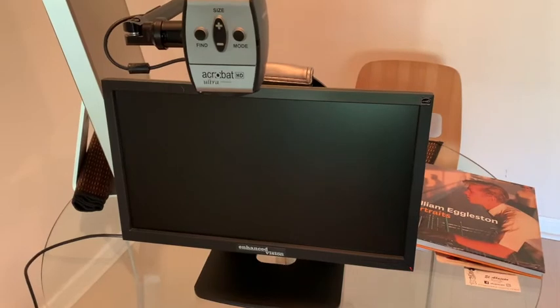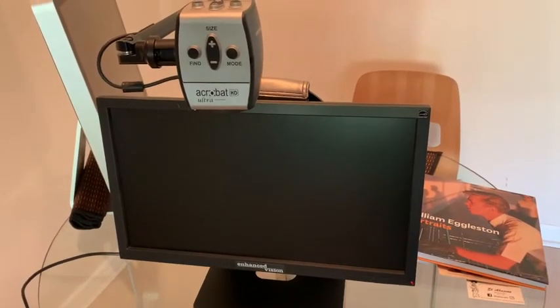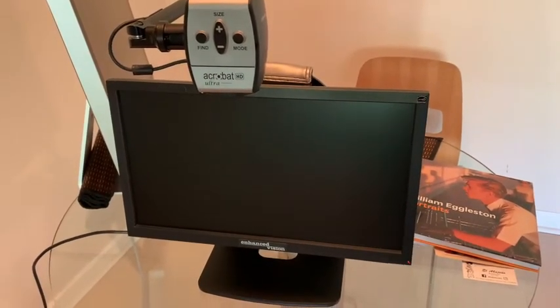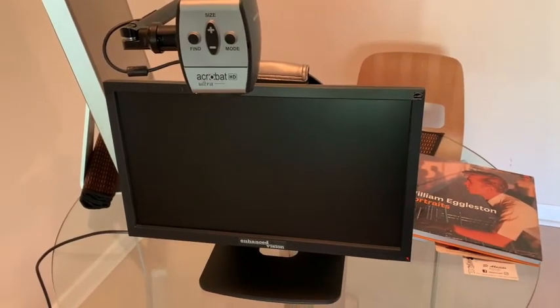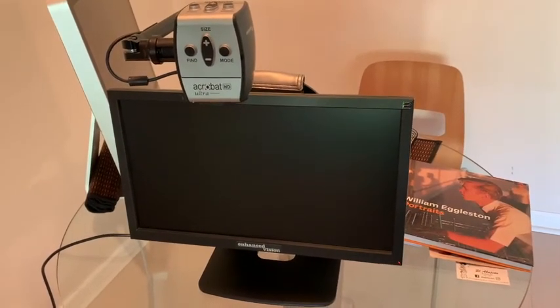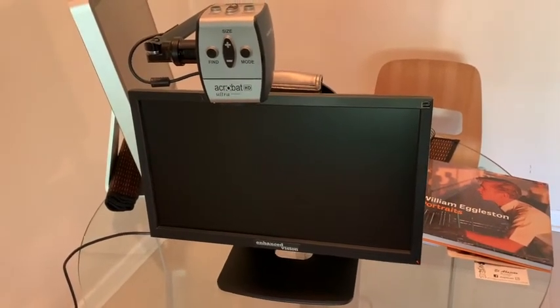Acrobat HD Ultra is a video magnifier, also known as a CCTV, made by Enhanced Vision. The great thing about this magnifier is not only can you magnify reading material for near vision, but you can also use the distance camera to read from far away — so distance viewing as well.